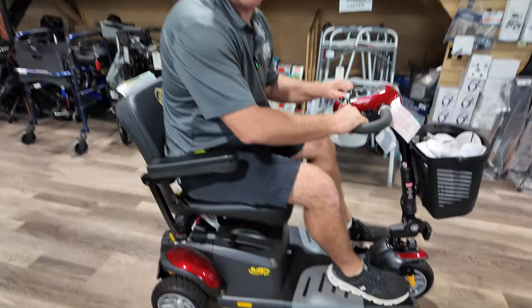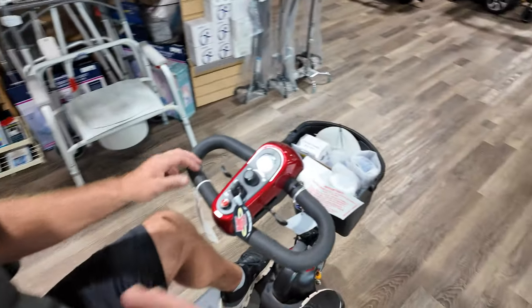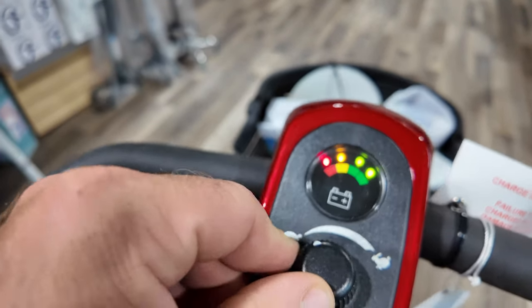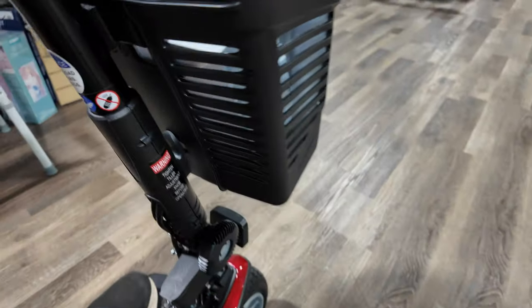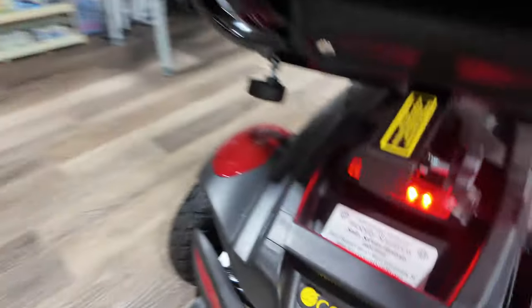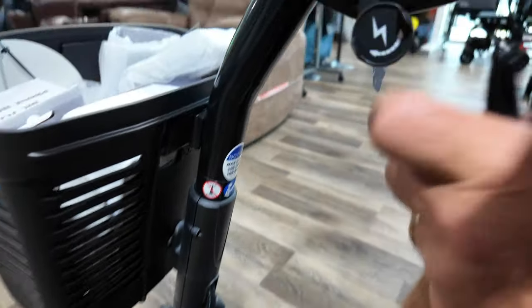It holds up to 350 pounds and there are different seats you can buy — a wider seat or one like this. Here's your dash: turn this on and you'll see your battery indicator, your speed, your key, your horn, and right over here you'll have a rocker switch for your front light. It also has a rear LED light. On this side you're going to find the charging port right here.